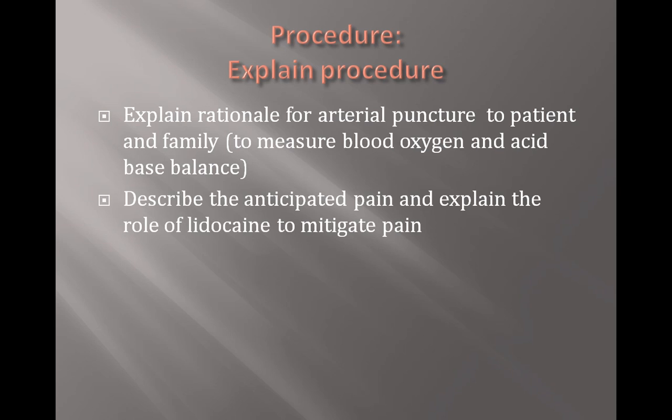Remind your patient that this can be painful and allow them to reconsider lidocaine. The majority of patients who have never had an ABG or are unable to recall a previous ABG puncture may assume this experience will be the same as a venous puncture, and it's not. So use the opportunity to set their expectations in line with what they're about to experience. It's a small measure that helps demonstrate your respect and can build trust.